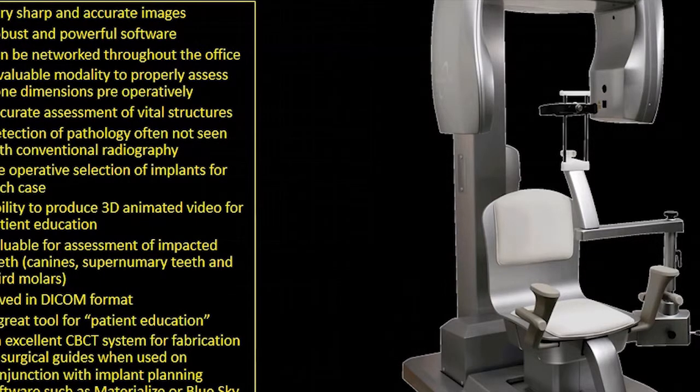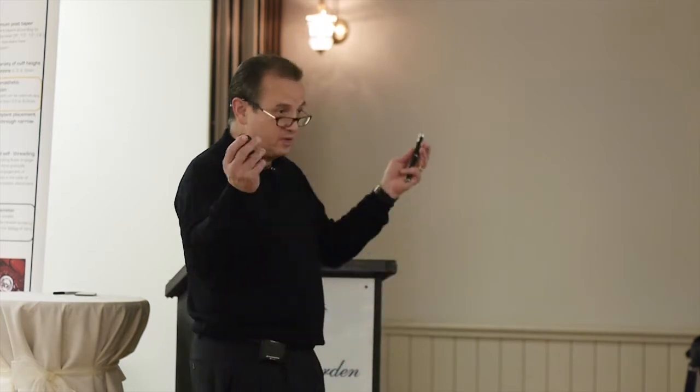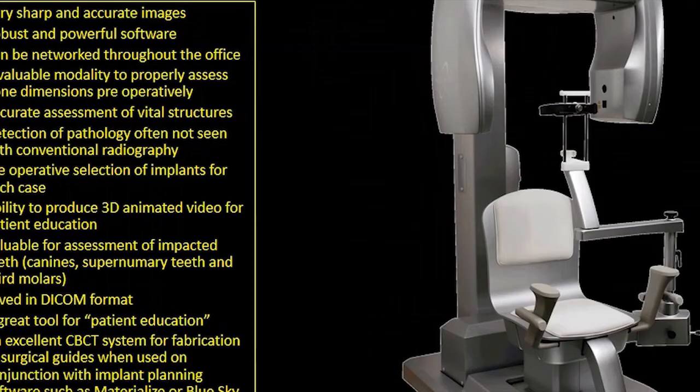We can produce a 3D animated video for patient education, which is pretty neat, and it's valuable for assessing impacted canine supernumerary teeth. It's saved in a DICOM format, so it's unlike, I guess, Sirona, where you got to have a Galileo, you got to have a Cerec. This is kind of open source? Yeah, open source. It's a great tool for patient education.